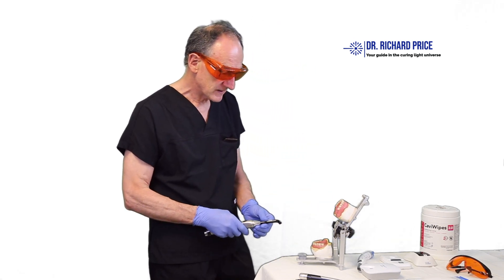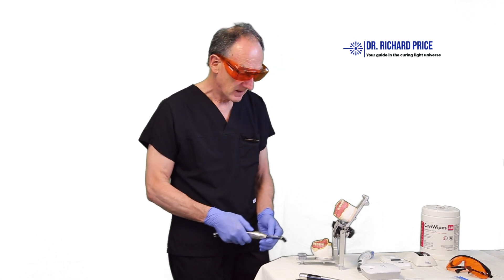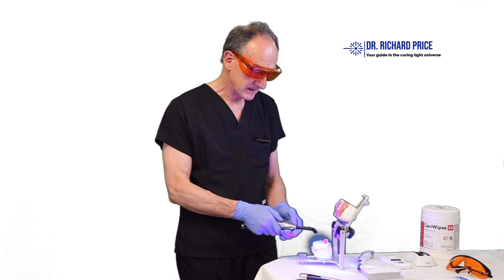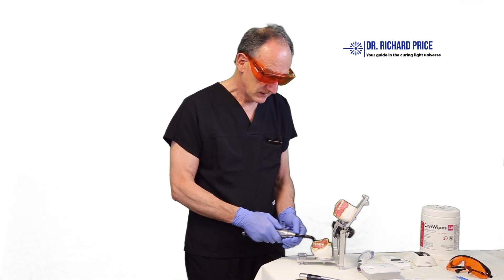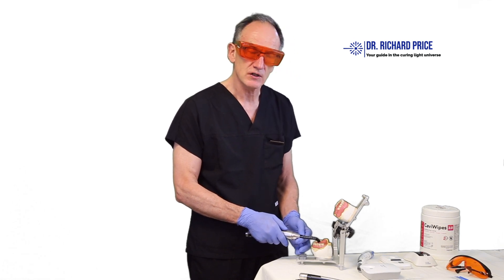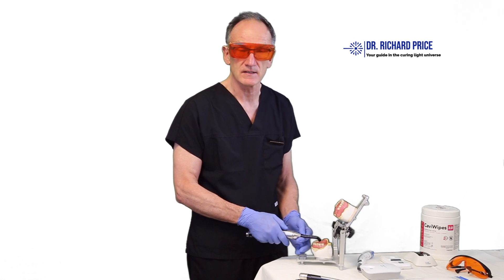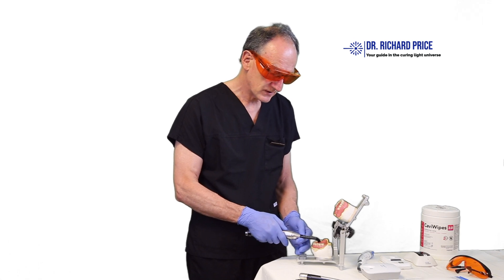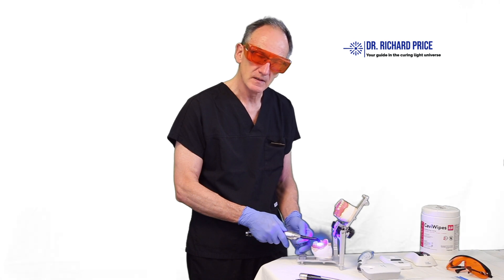Now some tips about light curing itself. Curing at a distance doesn't work very well — the top gets hard but the bottom doesn't. You need to make sure the curing light is as close as possible to the restoration. Don't touch it initially when the composite is still paste, as that will destroy the anatomy. Start the light curing just a few millimeters away, then bring it in really close, because the top hardens after just one or two seconds.